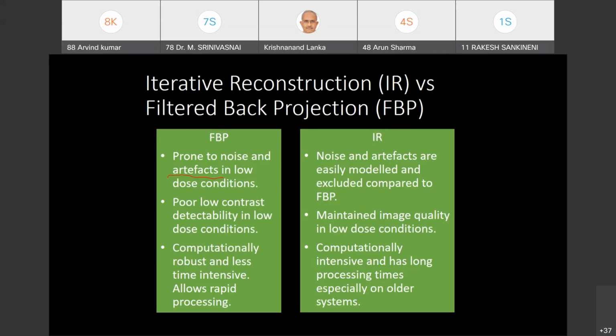So here you have to take the necessary precautions. You can't ask the patient to undergo surgery and remove that implant because that is fixed.